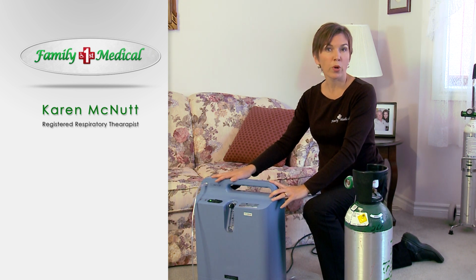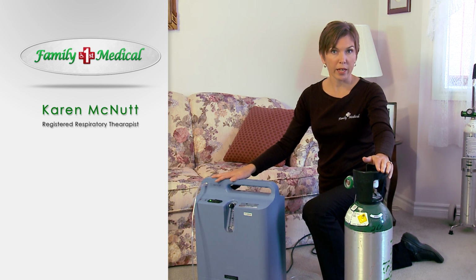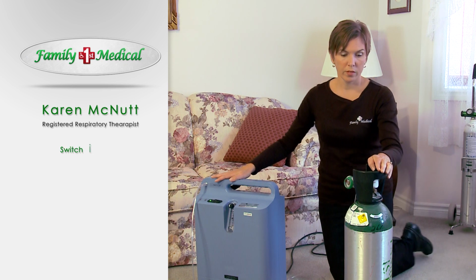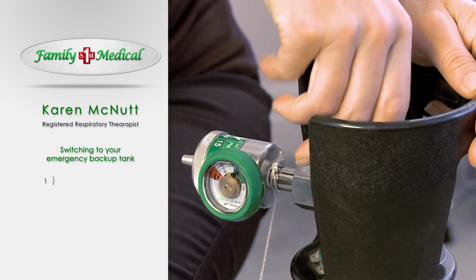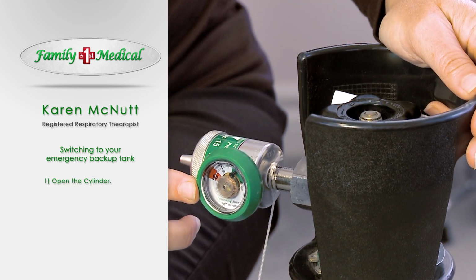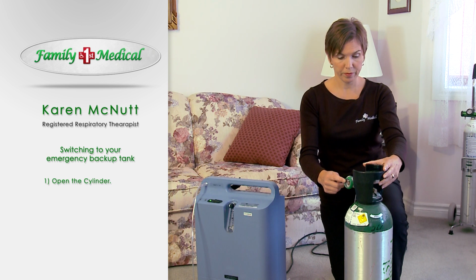Once you've determined there's a problem with the concentrator, we'll want to change the patient to their emergency backup tank. To do that, the steps are quite simple. First, we're going to open the cylinder. Simply turn the knob on the top with a few turns of your hand, counterclockwise. When the cylinder is open, the needle will show how much is in the tank. Remember, 2,000 is a full tank of oxygen.